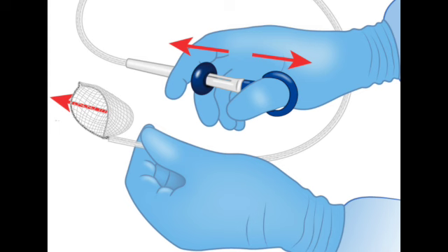First, how you retrieve polyps based on their size, small versus big. And second, maybe even more important, how you handle them correctly so the sample is actually useful for the pathologist, sample integrity. Right. So we're looking for those maybe surprising practical tricks and tools. The logistics. What actually happens when a polyp is small enough to get sucked up? And, well, what if it's just too big for that suction channel? Let's start with the small one.